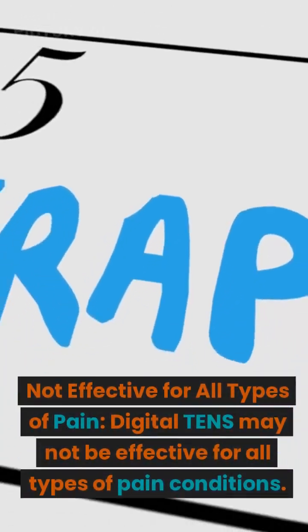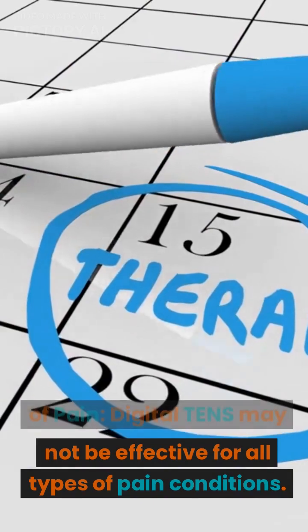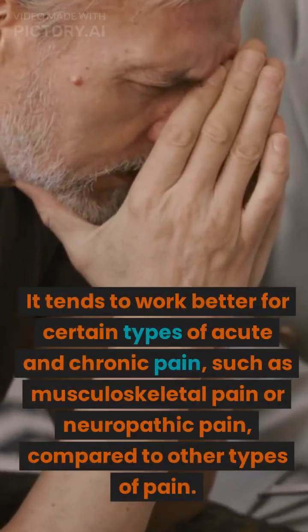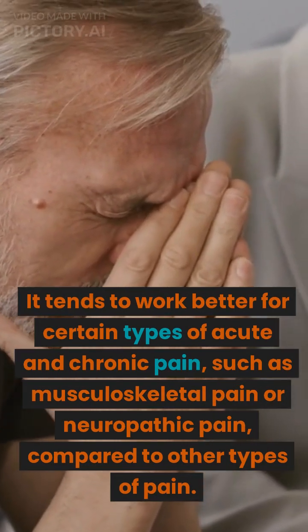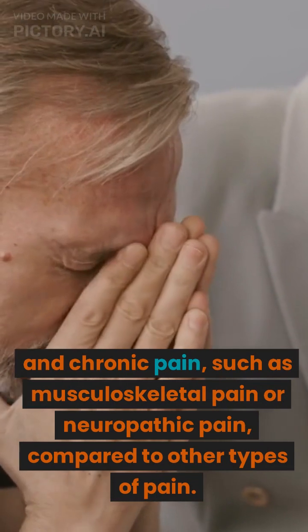Not effective for all types of pain. Digital TENS may not be effective for all types of pain conditions. It tends to work better for certain types of acute and chronic pain, such as musculoskeletal pain or neuropathic pain, compared to other types of pain.